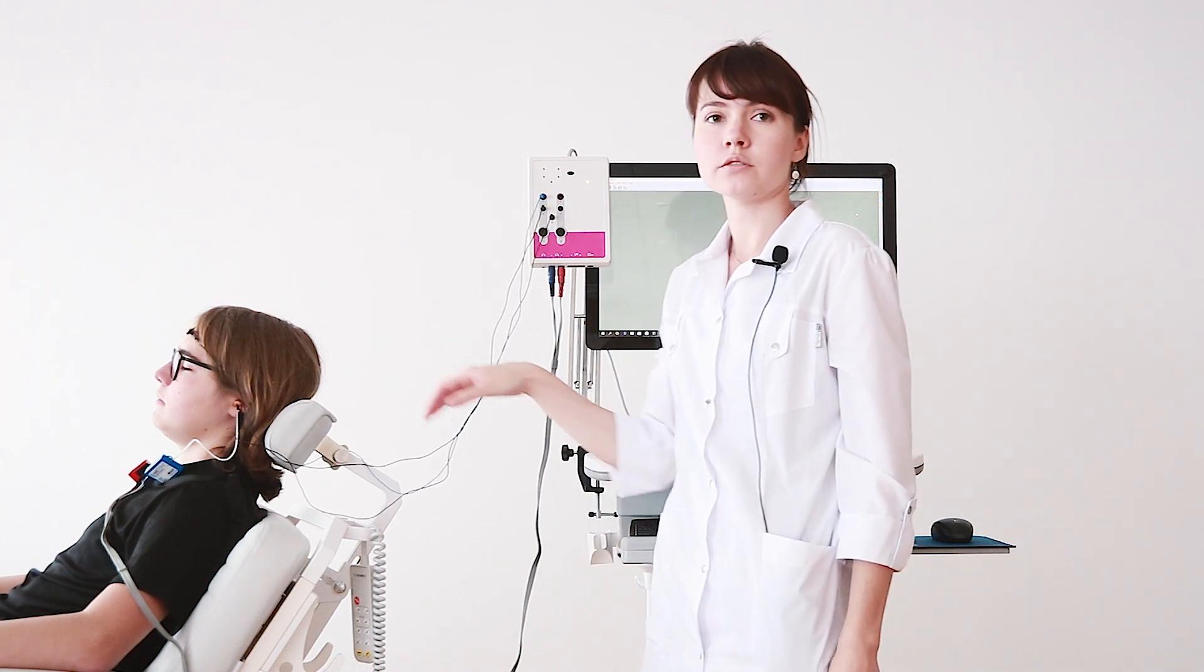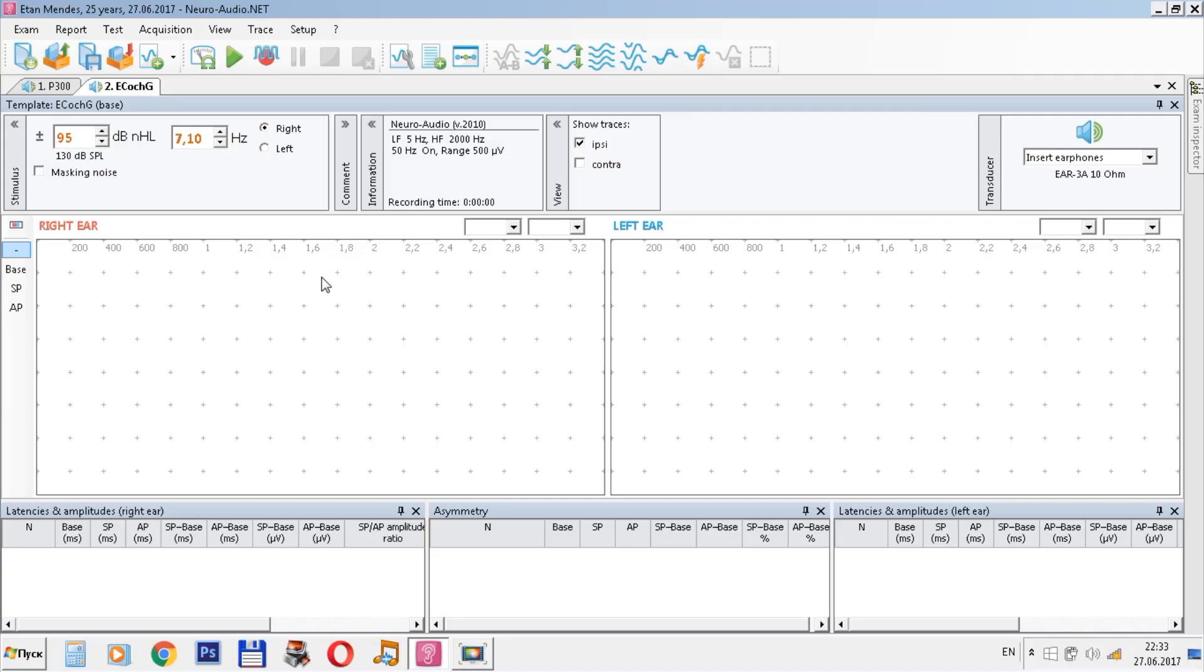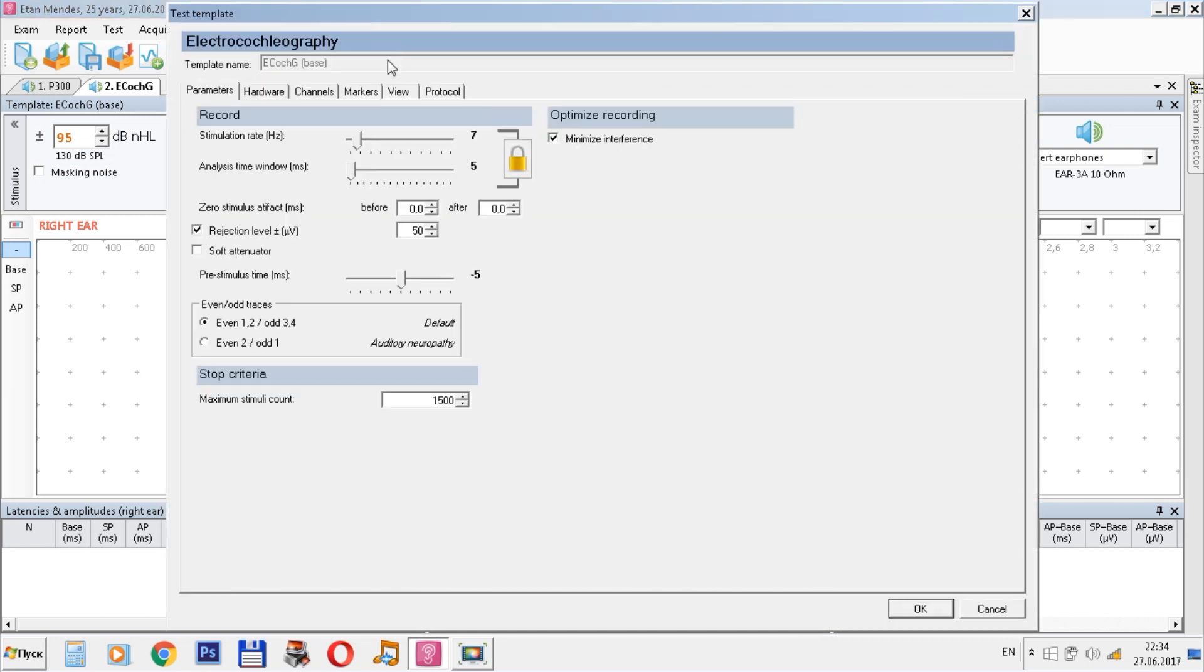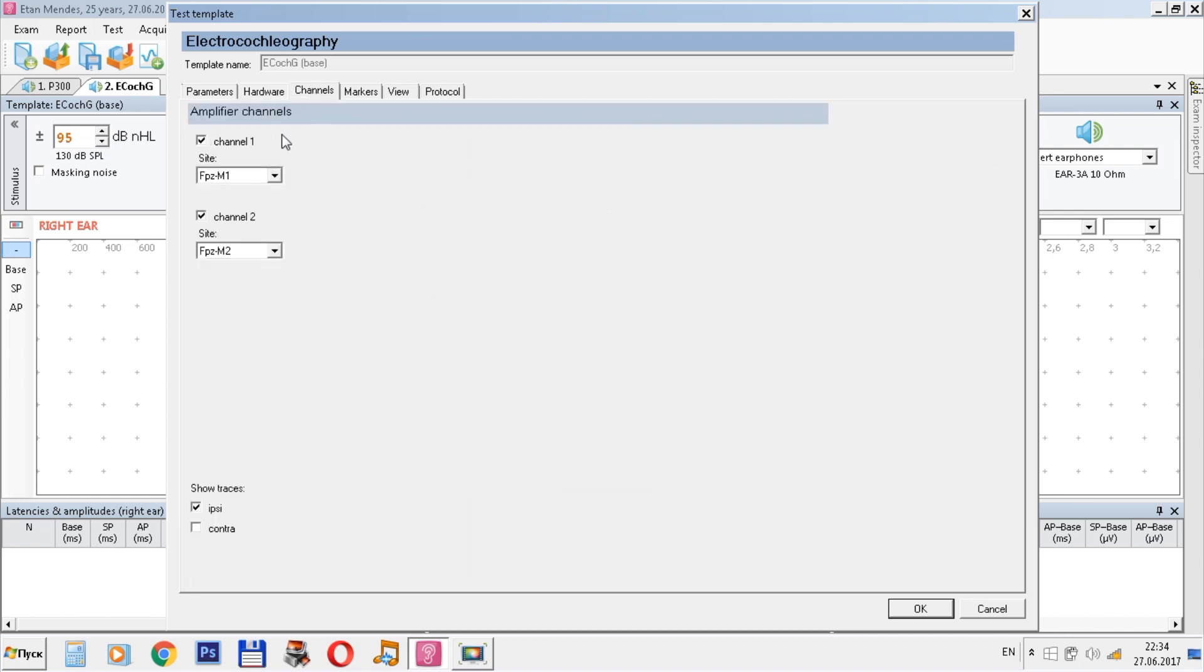And now we are ready to work in our Neeraudio.net program. We are in the electrocochleography window now. We can see the settings here: the stimulation rate, and we can choose the way to perform the stimuli. Here we can see the parameters of the hardware and stimulus. We use click stimulus now. Note that we use only one channel in this probe. Choose it and press OK.